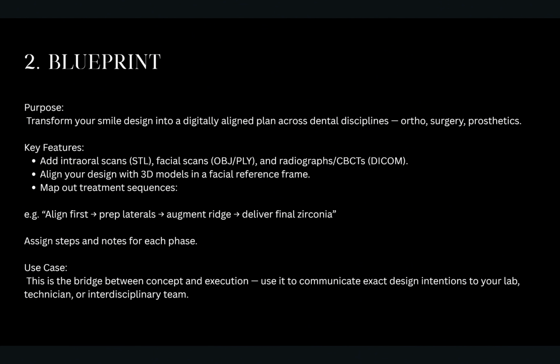And you align them with your design with models that are 3D within the facial reference and map out the treatment sequence. So you're able to annotate and say, plan is to align first, then prep the laterals, then augment the ridge, then deliver the final zirconia in that area. And you can assign these different steps and note each of the phases with different details. So maybe it's an expected timeline, or it's a projected costing, or it's a specific lab that you want working on that part of the case.